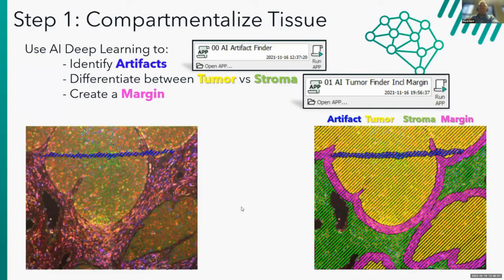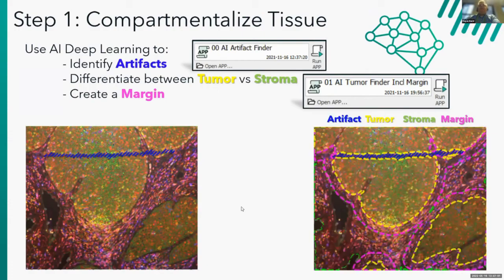We've trained it on several examples and validated that it works across the different areas of interest. We're then going to set those as what we call regions of interest for independent analysis. So anything that's in the yellow will be analyzed as one thing, and anything in the pink and anything in the green would be analyzed as different things.